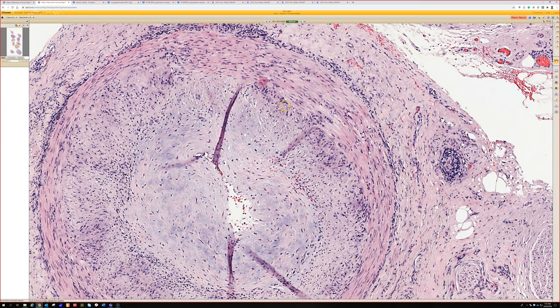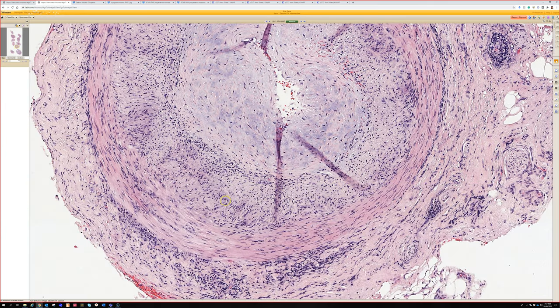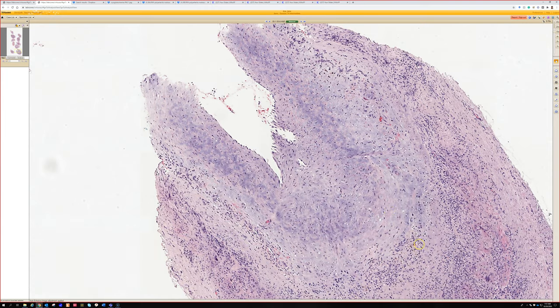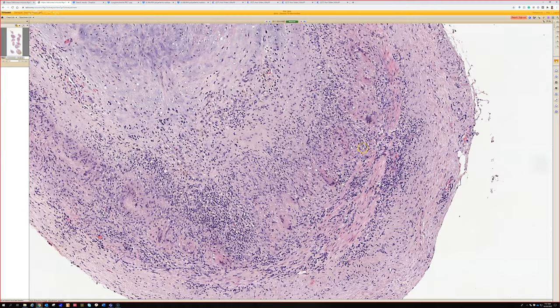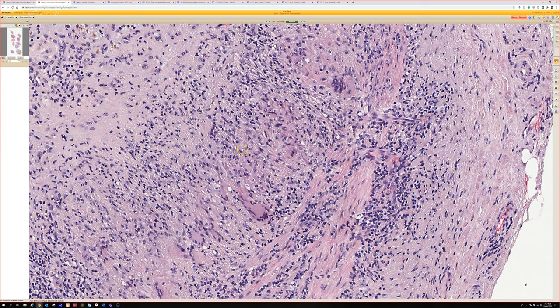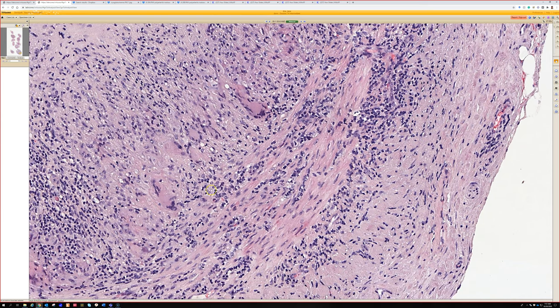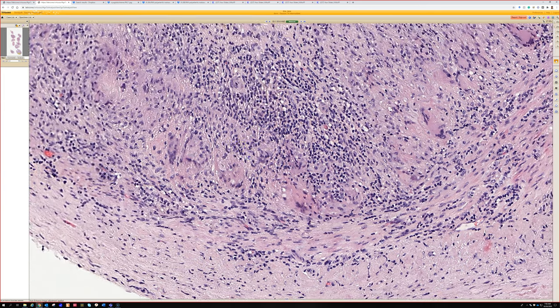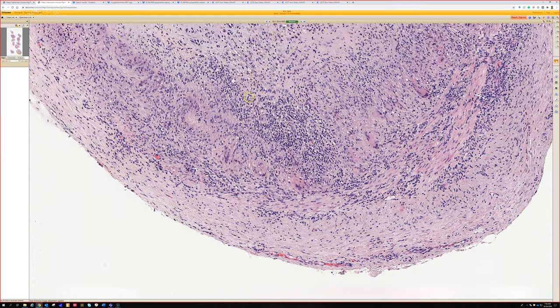The key here is that over here on this section, you can already see histiocytes and giant cells attacking the wall of the vessel, lining up right around where the elastic lamina is. There are going to be lymphocytes with them too. You can really see the giant cells — multinucleated giant cells — background loose mononuclear histiocytes, lymphocytes, just destroying the medial part of the vessel, right where the elastic lamina is between the intima and the media. This is a great example of giant cell arteritis.